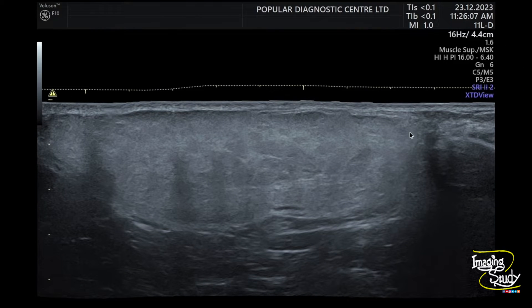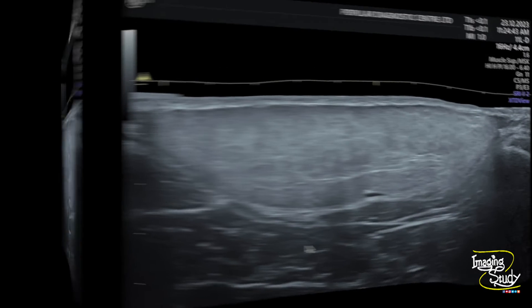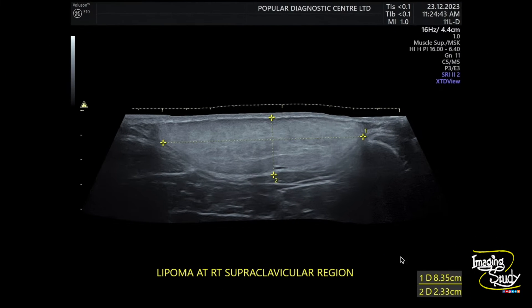You can see the lipoma at the subcutaneous layer. This is an extended superficial view or panoramic view. Here is another picture of the lipoma — you can see the capsule clearly. The lesion measures around 8.3 by 2.3 cm.